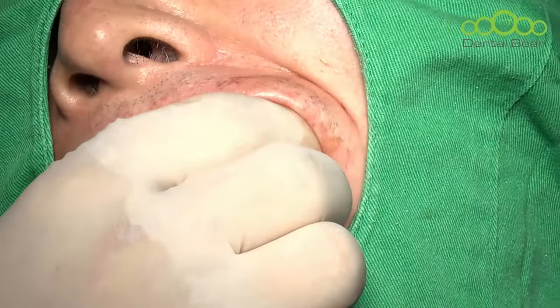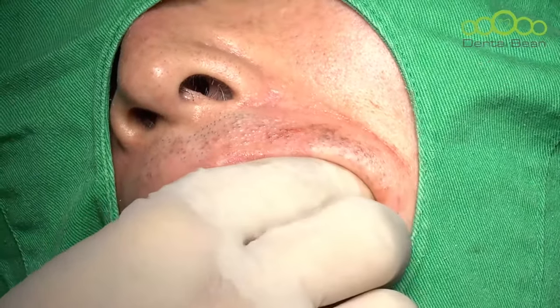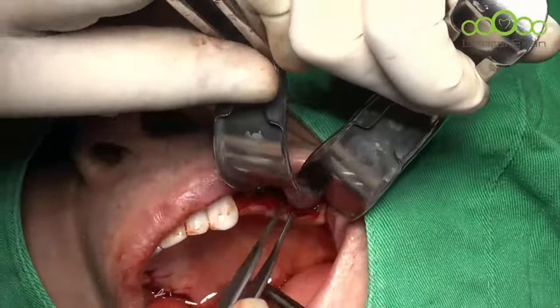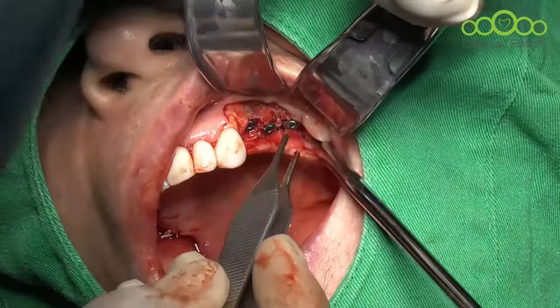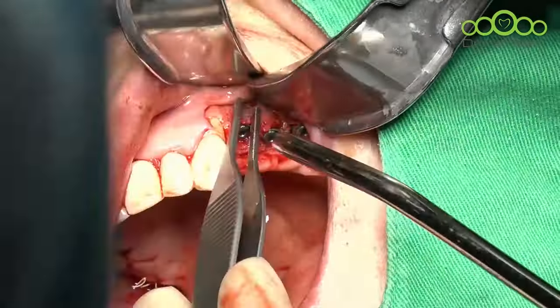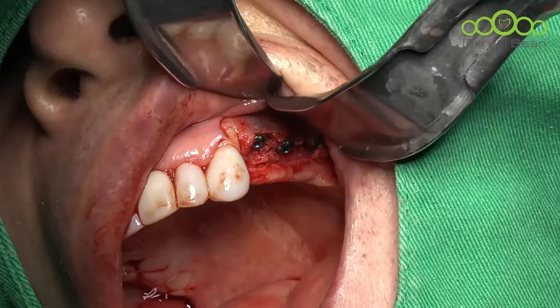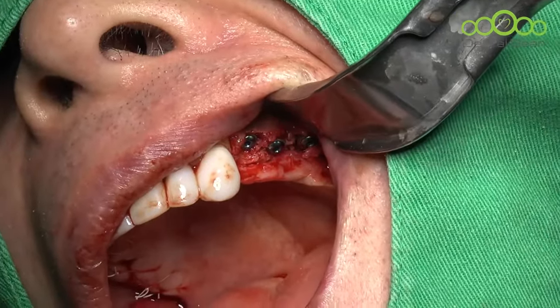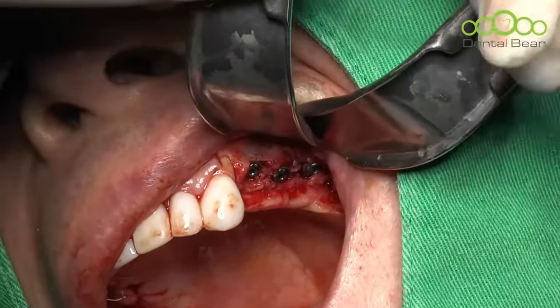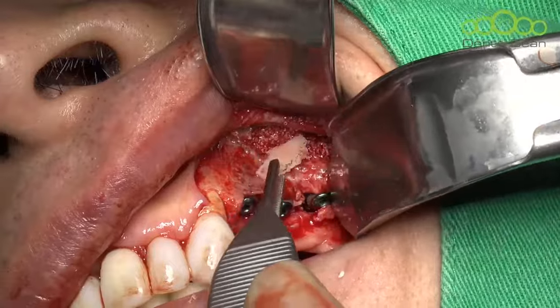Well, in the preoperative panoramic radiography, number 6 shows crestal bone loss. It is minor after implant installation, so no need for a special GBR in such a case. Instead, this side looks slightly narrow. I can simply reposition the bone window. Okay, very simply reposition the bone window. Okay. Close. Look next. Here, I can simply reposition the bone window.